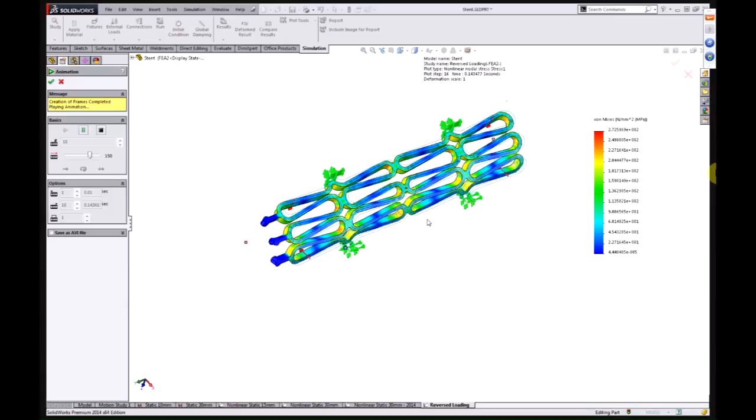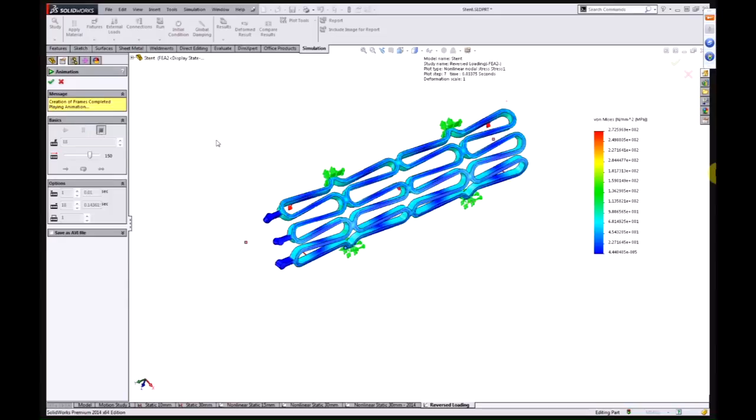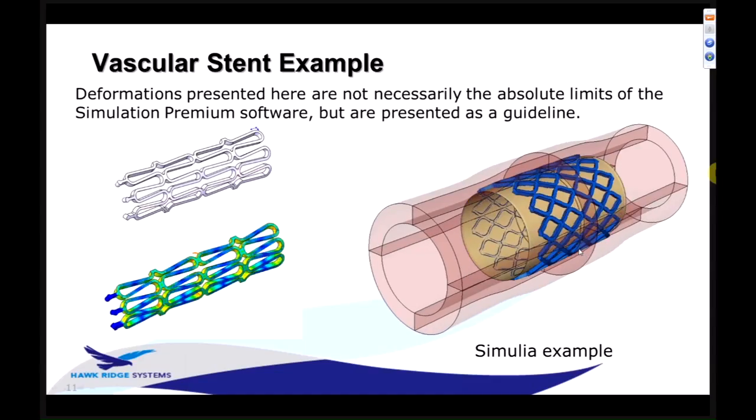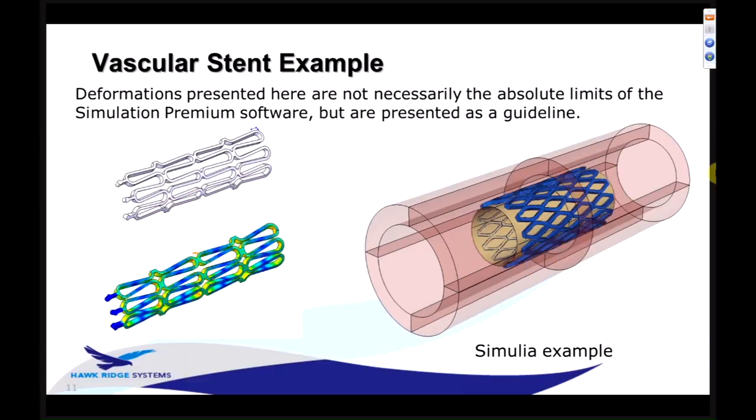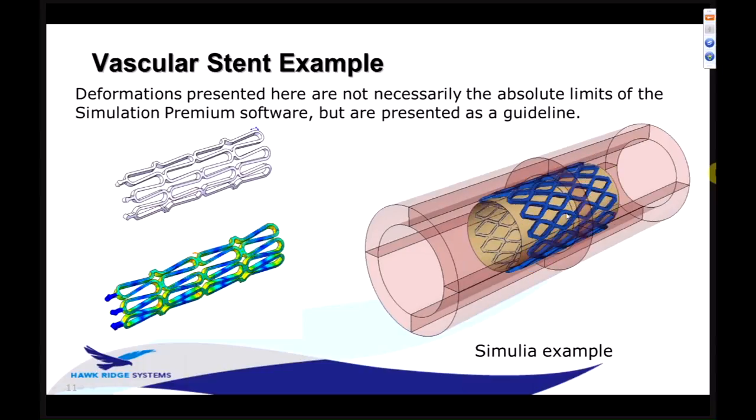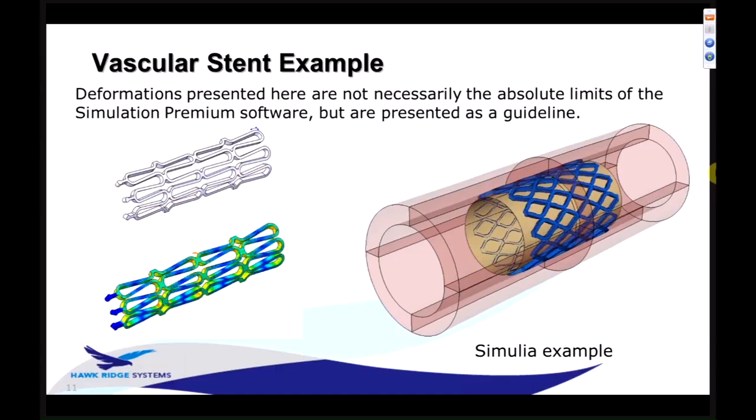In this little graphical example here, we have two sets of contact interaction. We've got an internal balloon, and we've got an external arterial vessel wall that we're deforming that's made of a biomaterial, so we've got a unique material model for that. We've got a material model for the stent. Abaqus is better equipped to handle the large distortion and the contact conditions all at once. So it's a ballpark idea of the differences between the tools. They are both doing fundamentally the same thing, but there is a difference in how far you can push the distortion and the deformation of the nonlinear solver in Simulation Premium.